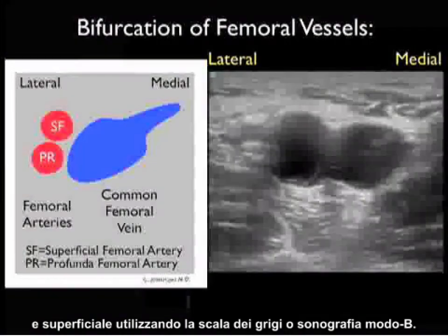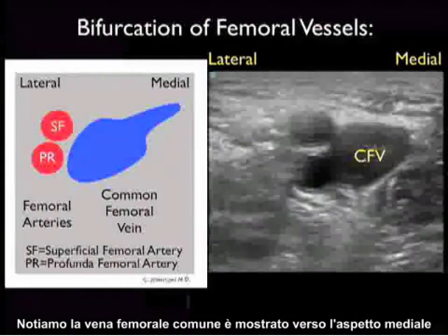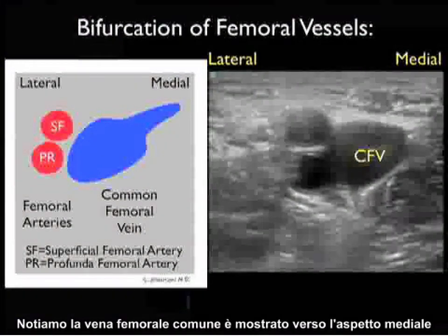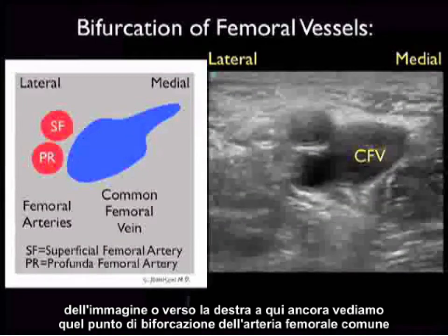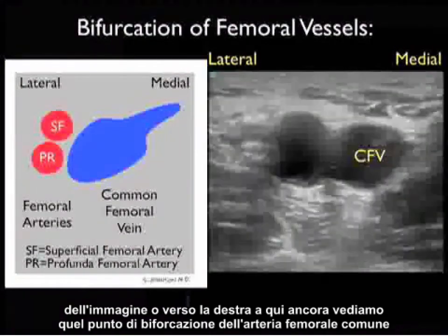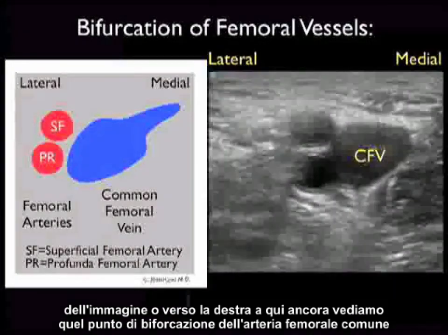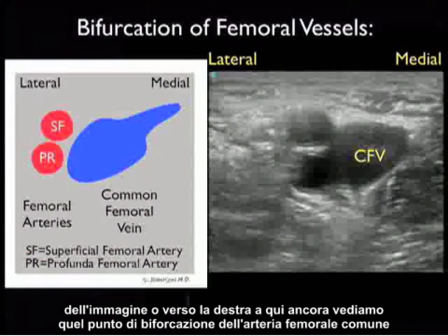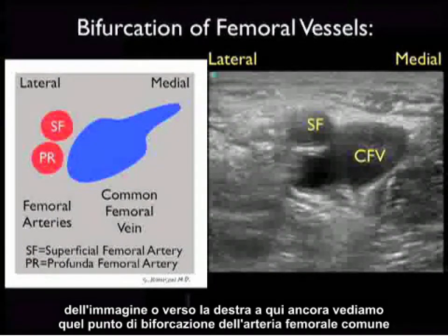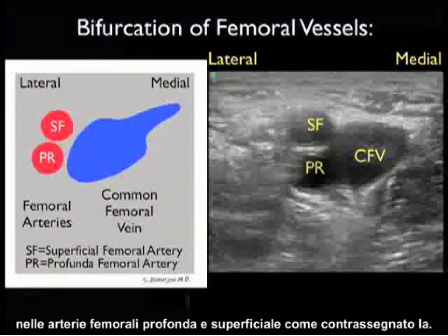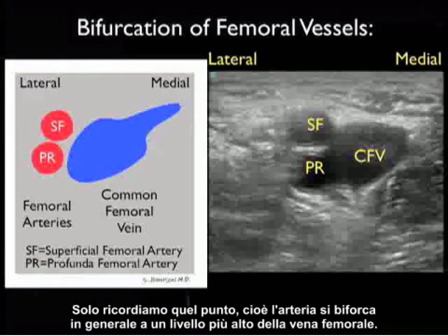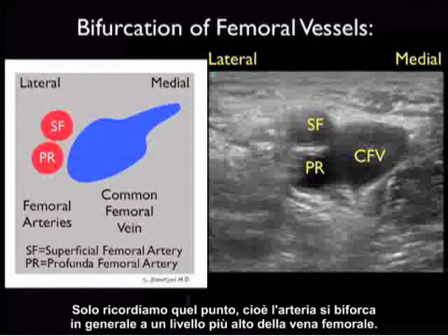In this video clip we note the bifurcation of the common femoral artery into superficial and profundus femoral arteries using grayscale or B-mode sonography. The common femoral vein is shown towards the medial aspect of the image, and here again we see that bifurcation point of the common femoral artery into the superficial and profundus femoral arteries. We remember that the artery generally bifurcates at a level higher than the femoral vein.